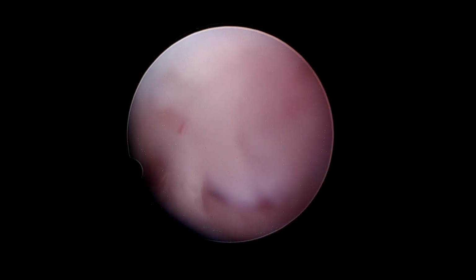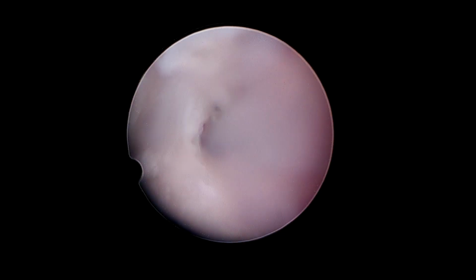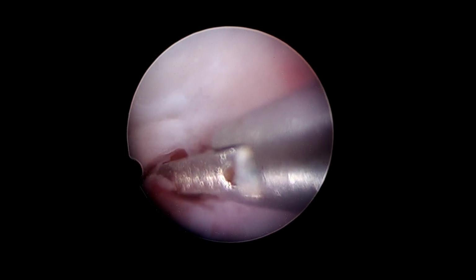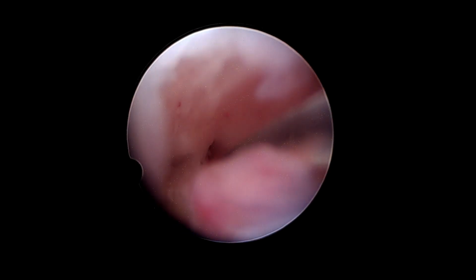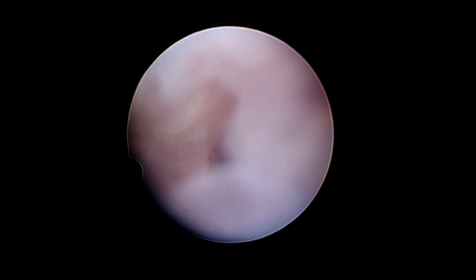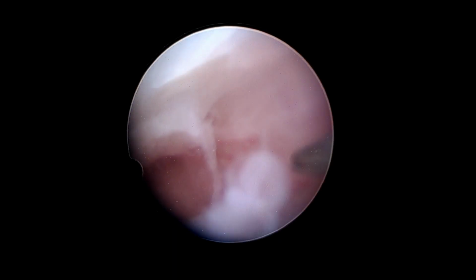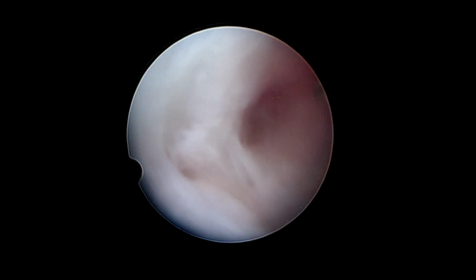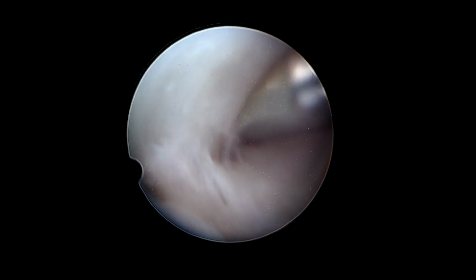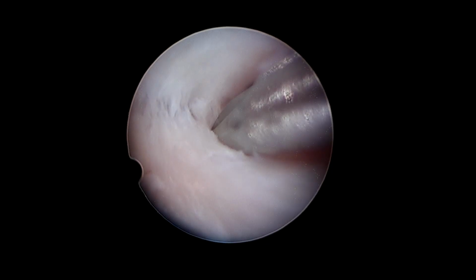We did the probe test for this patient, and this is the ideal thing to do. The probe test is pushing the instrument into the uterine cavity and identifying the opening of the uterine cavity, and once you identify it, you can cut these adhesions keeping that point of probe as a reference point, and then you can advance. Here also we cannot see anything, but you can see the gray dot, and we have pushed the scissors through it, and this is a probe test.